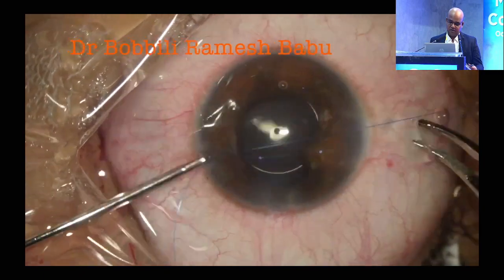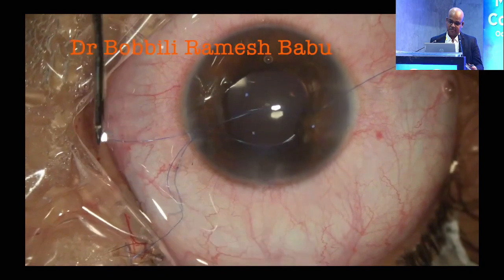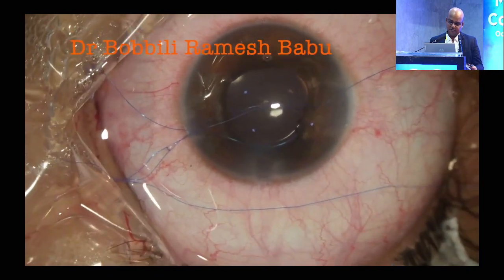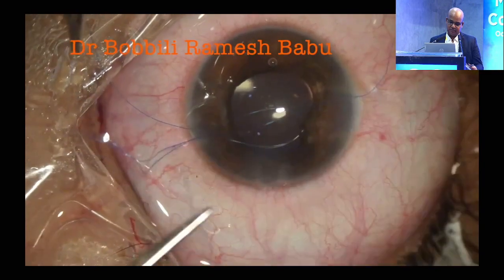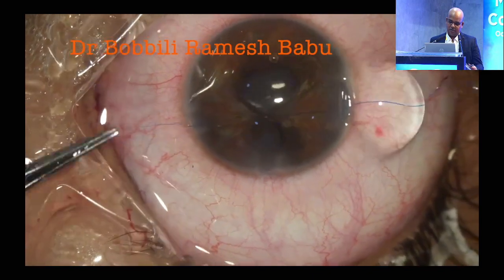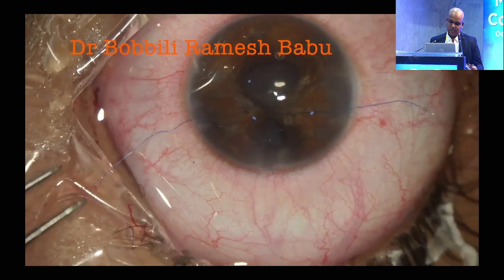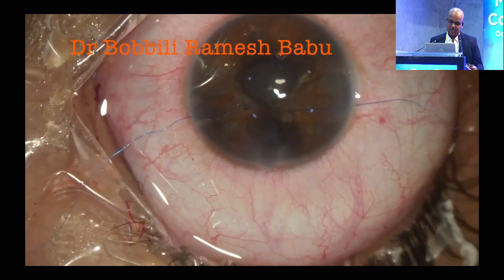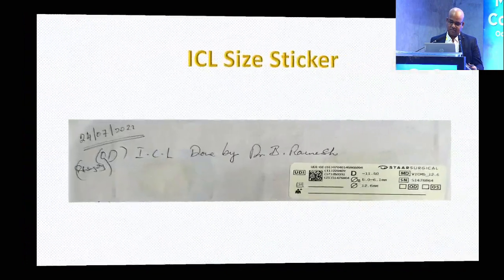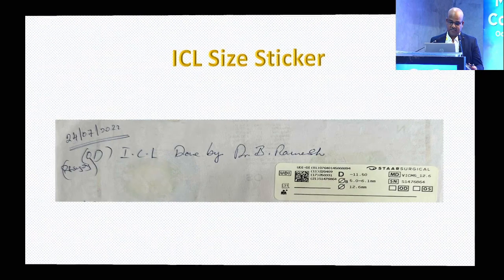Round and small, to decrease the glare of the patient. Four throws are being made. Then the suture is pulled on both sides to get a small pupil. This is not sufficient, and one more is made to get a satisfactory result. So this was the size. We have undersized the lens to 12.6.